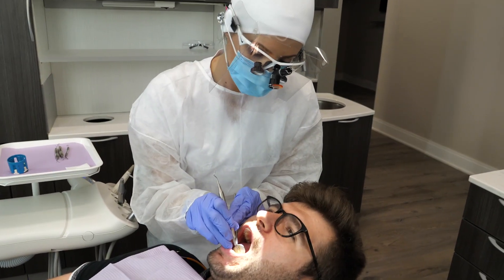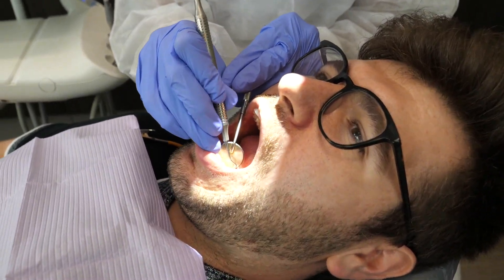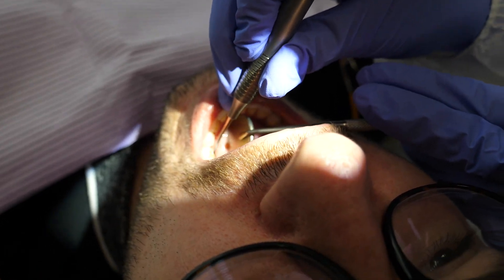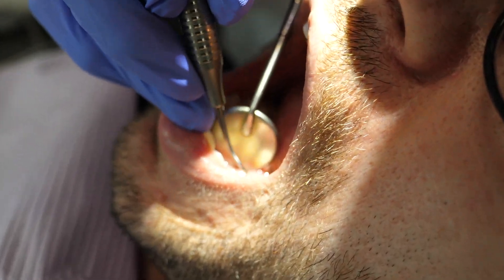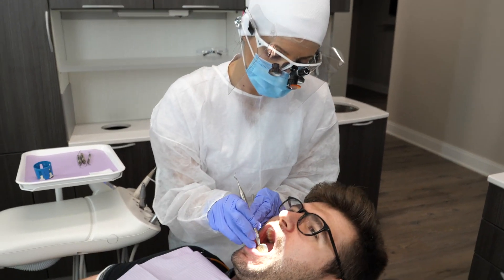Then I always go in with a scaler next. A scaler is my most comfortable instrument, especially for calculus detection. It helps me feel what I'm removing, and if there are any grainy little pieces of tartar left, I know they're there and I can get in there specifically feeling what I'm doing.